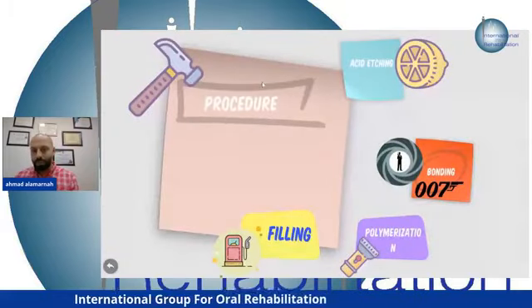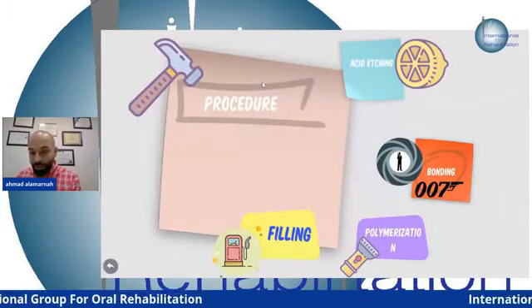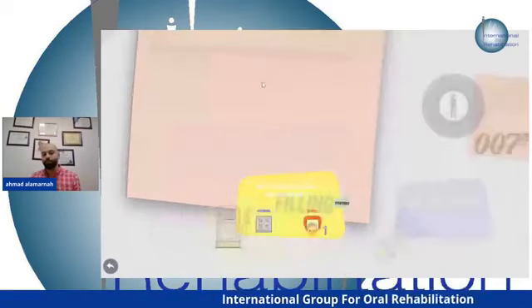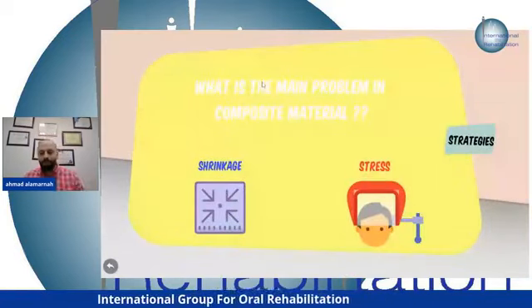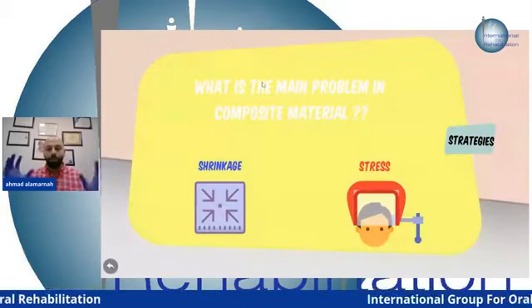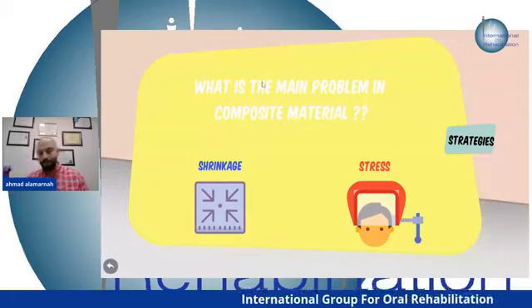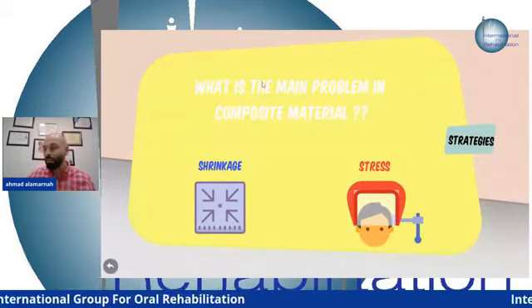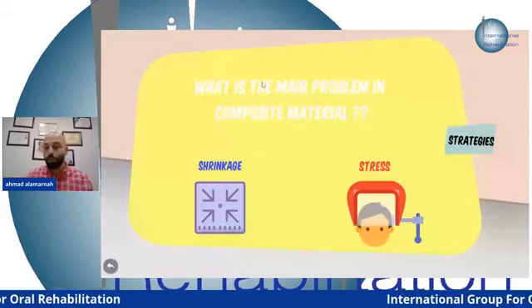We finished the acid etching, the bonding, polymerization. Okay, let's talk about the filling. What's the main problem of the composite restoration? The shrinkage that will cause the stress. The shrinkage is always toward the center. The composite shrinks toward the center.